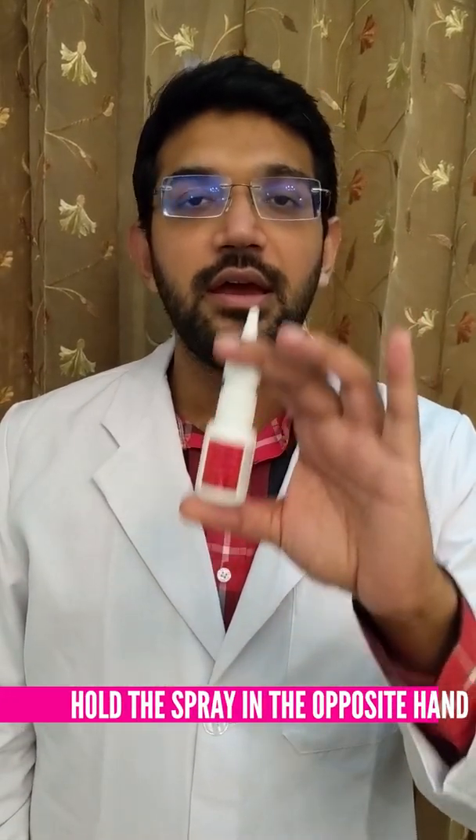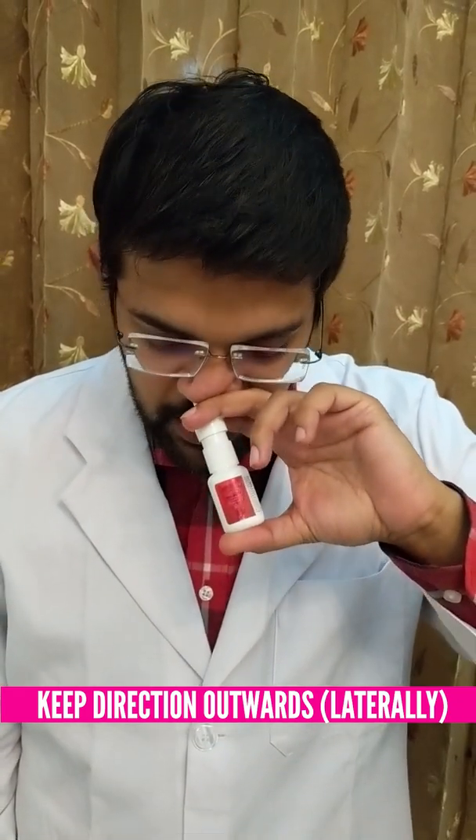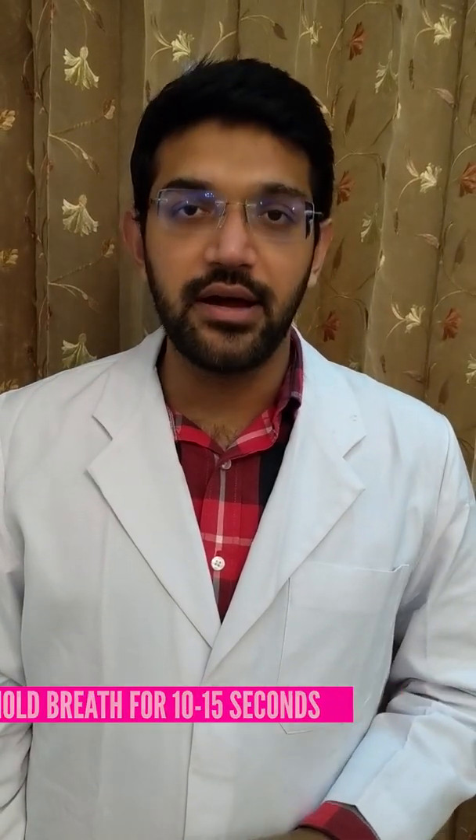We hold the spray in our left hand and spray in our right nostril. Again, keeping the direction outwards and bending our head downwards, we spray once. We sniff a little bit and hold our breath for 10 to 15 seconds. A forceful inspiration will cause the medicine to enter our chest, reducing its efficacy and also causing a bitter taste in our mouth.